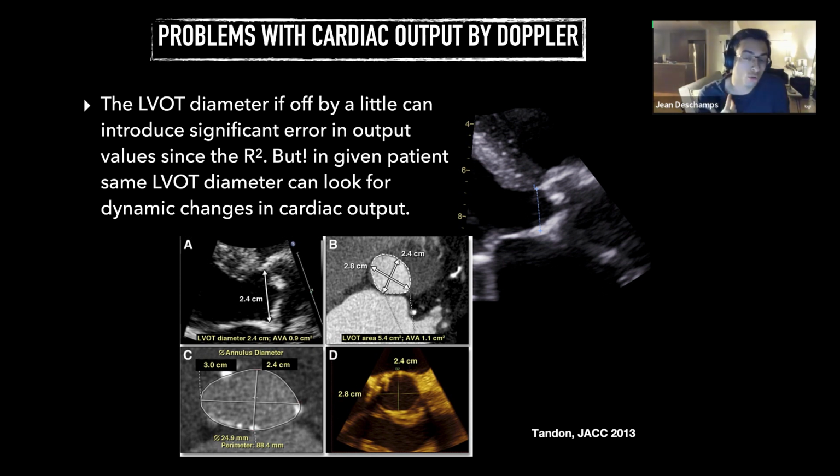But even the normal aorta, you can have a wide variation depending on how you measure and angle it. And because you're doing a 2D measurement in parasternal long axis, you can easily change where you're cutting and have a big impact on the total diameter that you measure, which, because it's squared, can make a fair amount of difference to your cardiac output as well.